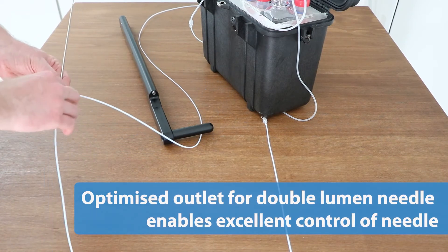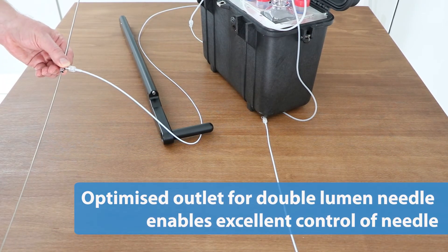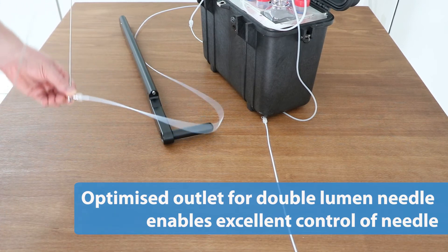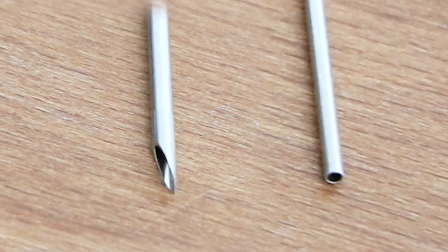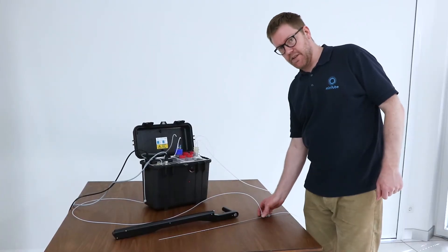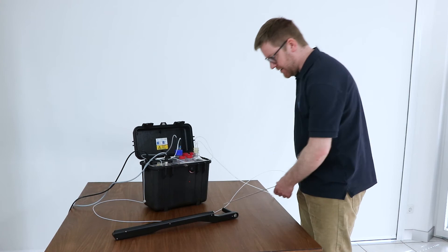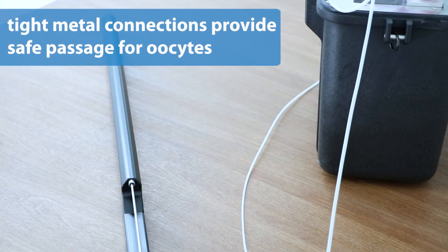The needle is a double lumen needle with the inner part for aspiration and the outer part for injection. It is entirely made of steel and can be sterilized easily. The needle is inserted into the needle guide and becomes visible on screen during the procedure.